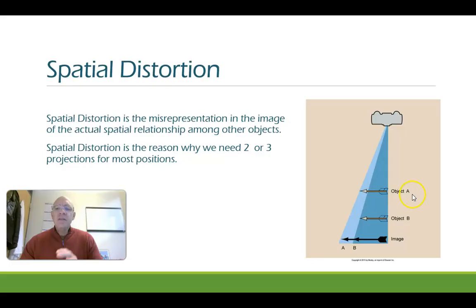It's for reasons like this that it becomes important to realize that we need two planes of view when dealing with X-ray images. Just getting one plane of view is usually not enough for most things. Of course, we only do one view pelvises. We only do one view abdomens usually. But when we're dealing with broken bones, we usually try to get two, maybe three planes of view in order to truly understand what's going on with the image.